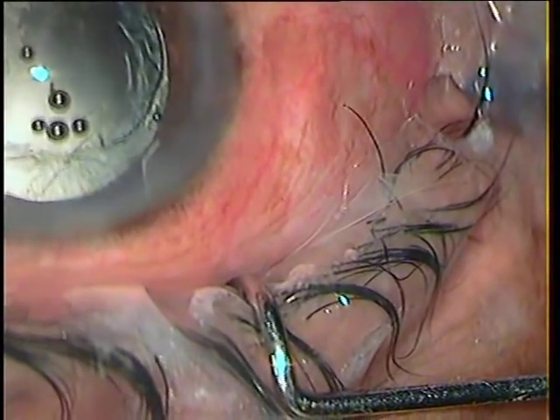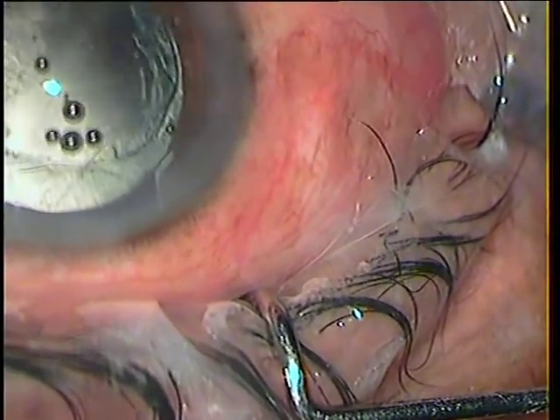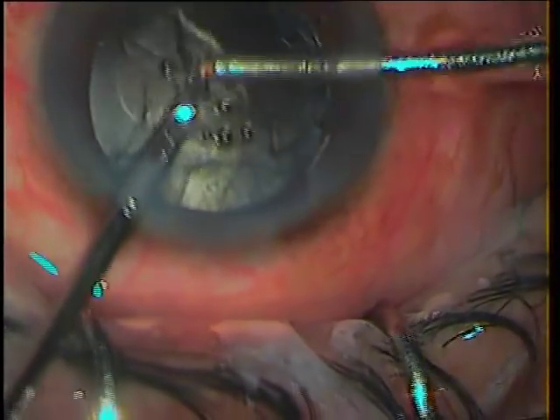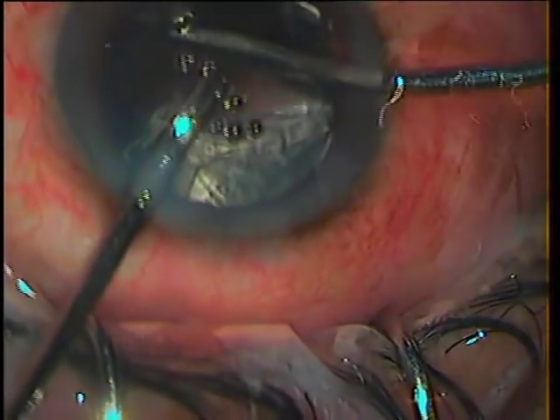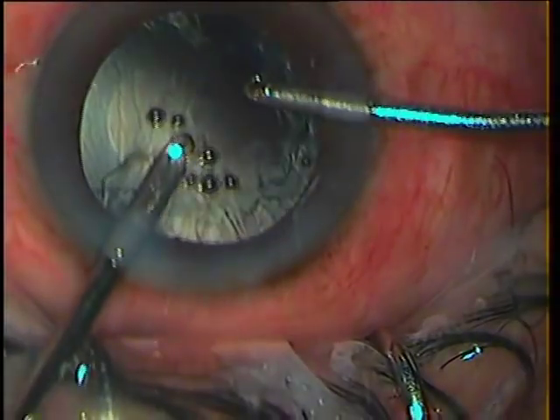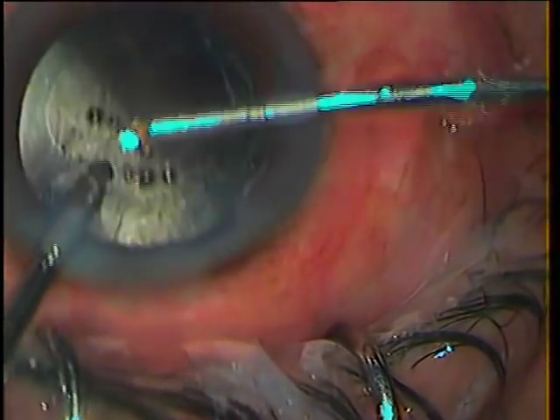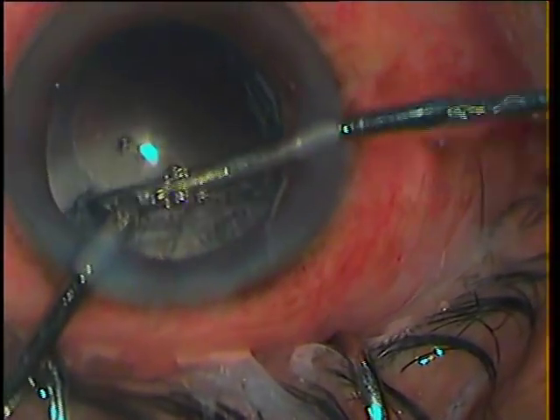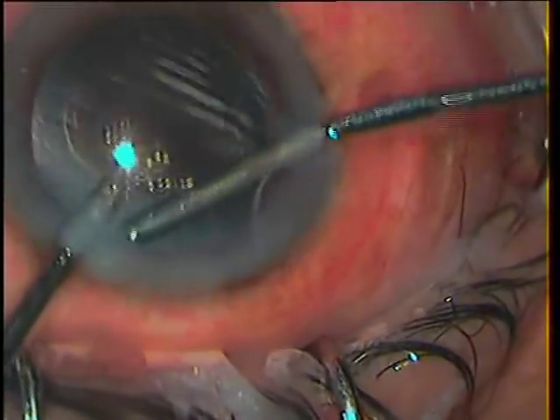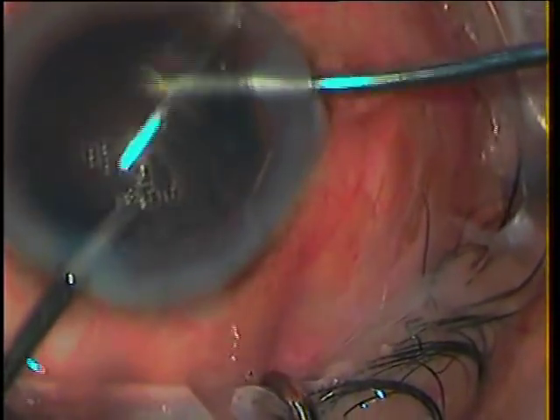This happens quite often — I am sorry it is a bit off-centre, but I was more worried about the case than the focusing. I am showing the vitrectomy in high speed, though I was working quite gently. With the vitreous cleaned up in the AC, cortex removal wasn't a problem, and it was almost like I would have done with the posterior capsule intact.